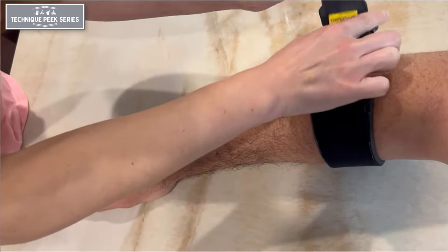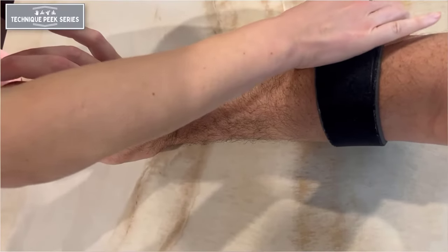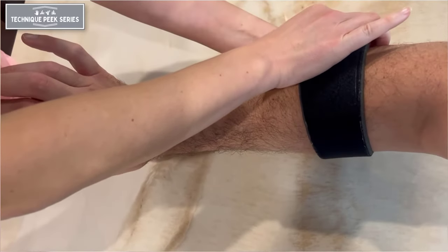Prior to fastening the strap, have the patient actively extend their wrist to elevate the wrist extensors. While the wrist is extended, fasten the strap.